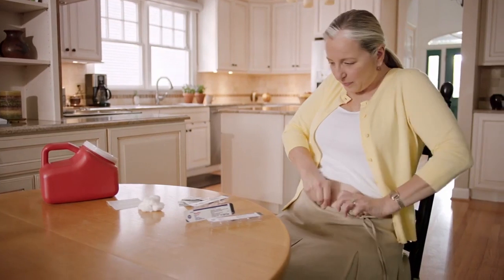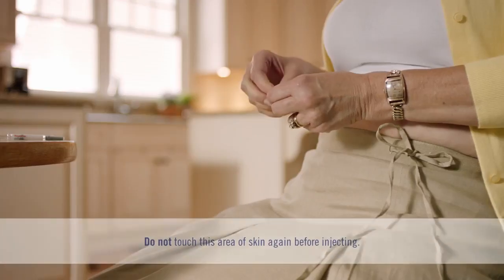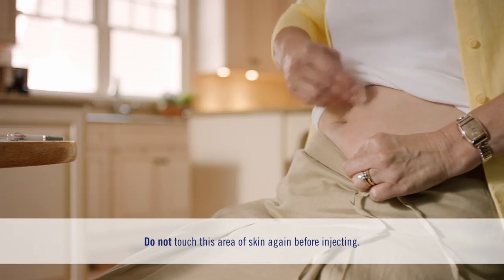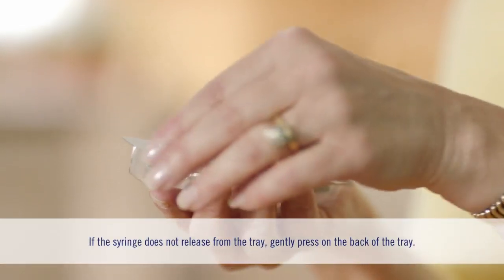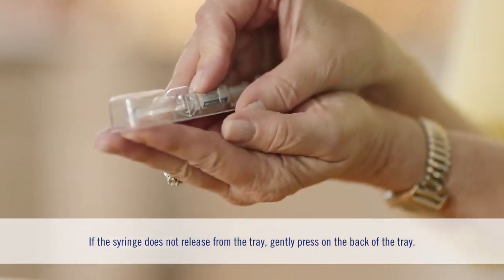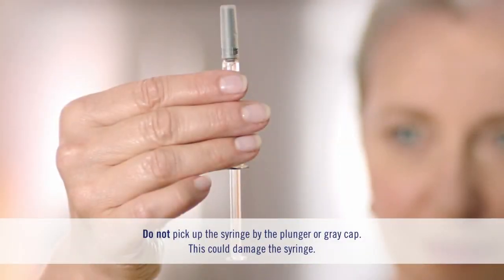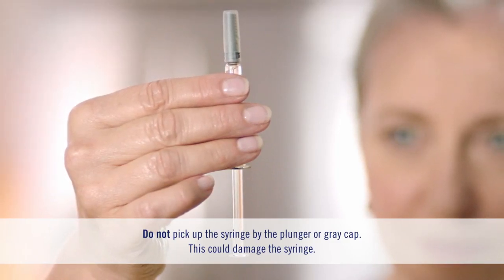First, clean the injection site with an alcohol wipe. Let it dry and don't touch this area again until you're ready to inject. Next, peel the paper off the tray and place the tray on your hand. Then turn the tray over and gently press the back of the tray with your other hand. The syringe should pop out from the tray onto your hand. Be careful not to pick up the syringe by the plunger rod or gray cap — always hold the syringe by the barrel.